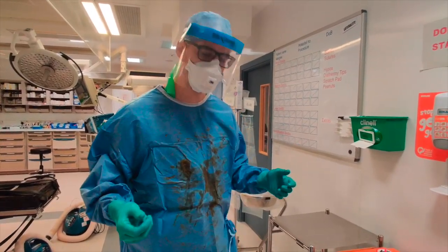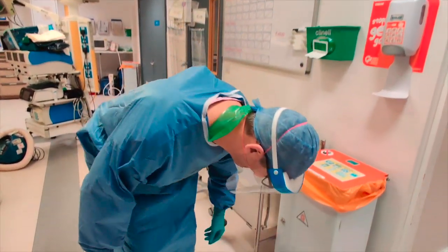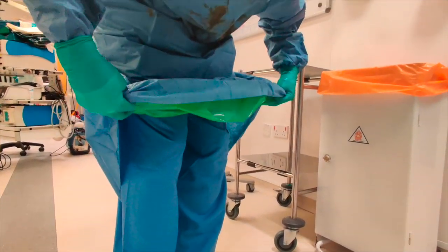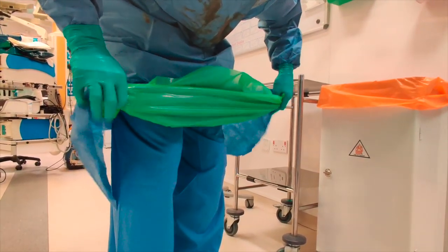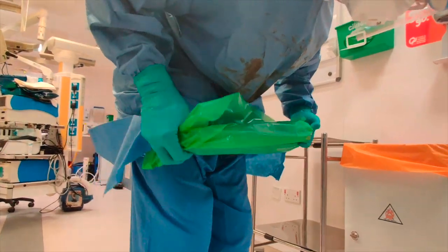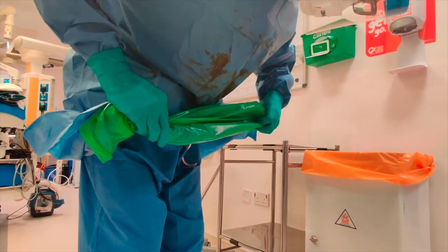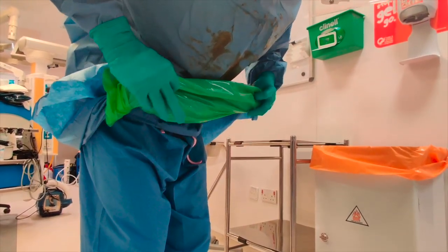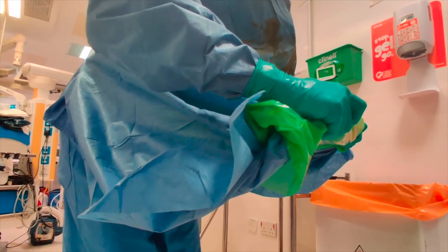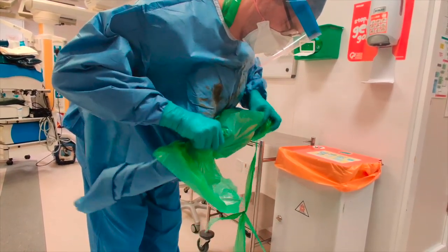I'm going to demonstrate how to take off the gown. I'm going to lean slightly forward so the ties are loose, then come forward and take both the gown, the plastic underneath, and the outside of the gown — making sure I've got the corners involved — bending forward and creating a rolling pattern, gently pulling inward so as not to contaminate.